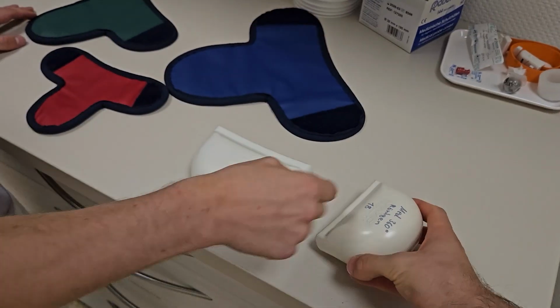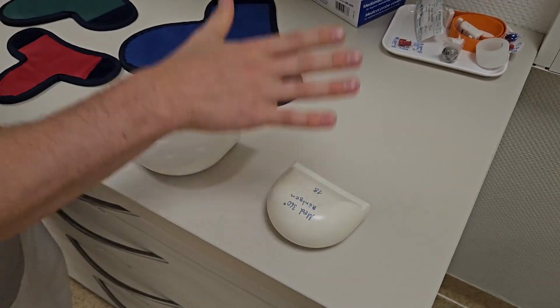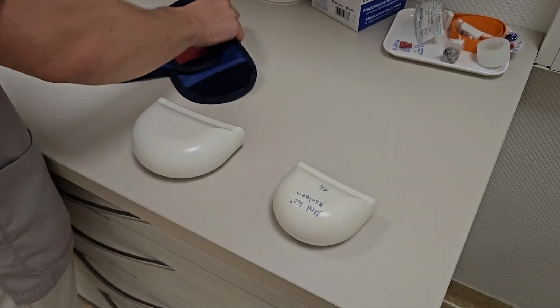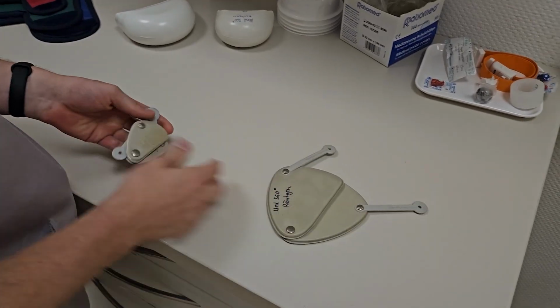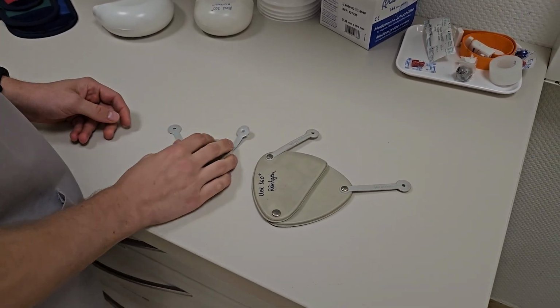But of course, if the hip is exposed, you need something like this. Of course, it is not placed in front of the measuring chamber, otherwise we'll have to expose twice and that would not be in the interest of radiation protection. And for the woman, there are these lead butterflies. You kinda have to be able to feel it and place it accordingly. That Heel-Effekt that we just learned can also be used for radiation protection.